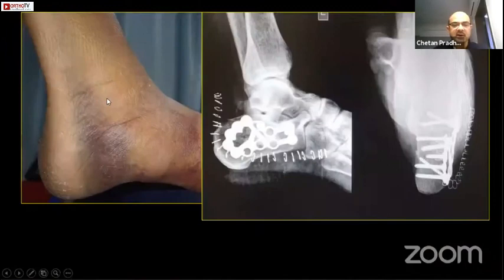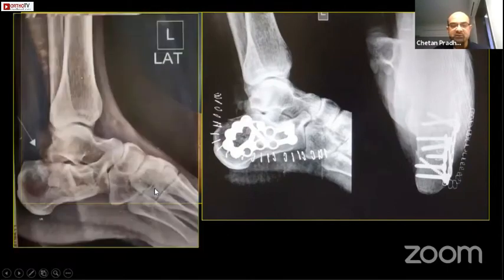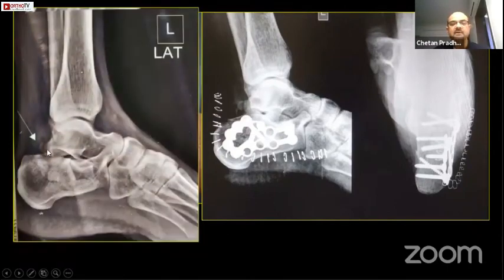You wait until you see the wrinkling — I had to wait for almost a week in this case. These are the immediate post-op X-rays. You can see that the depression has been adequately corrected, the varus has been corrected, and this is a perimeter plate which has been applied.